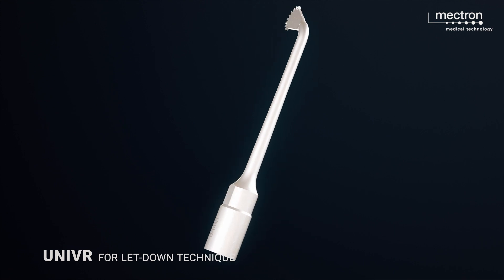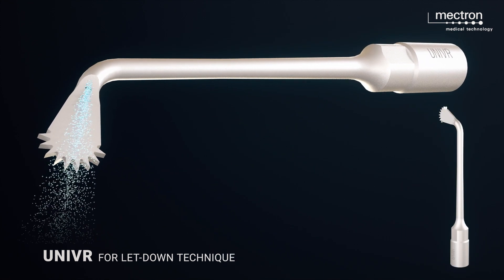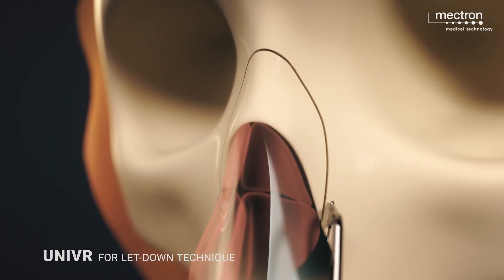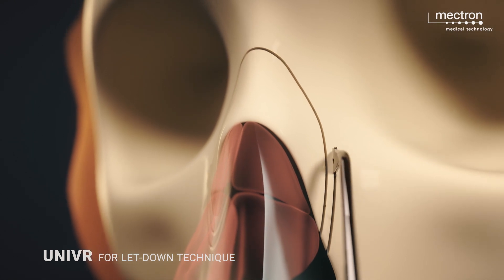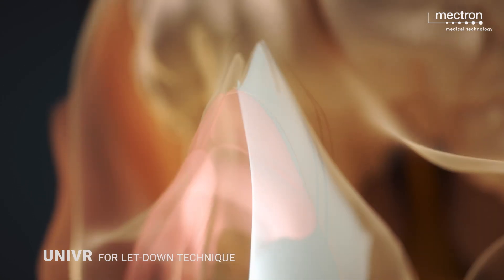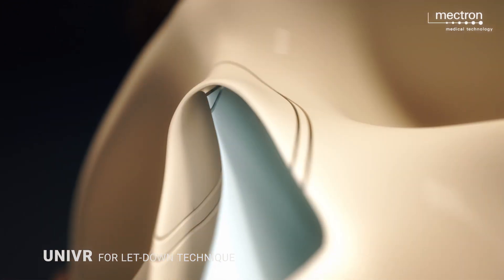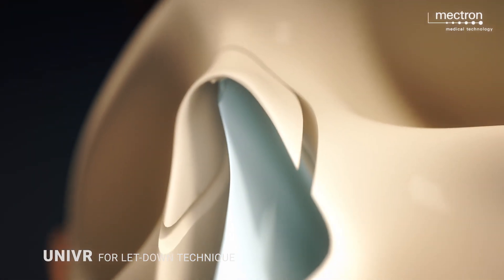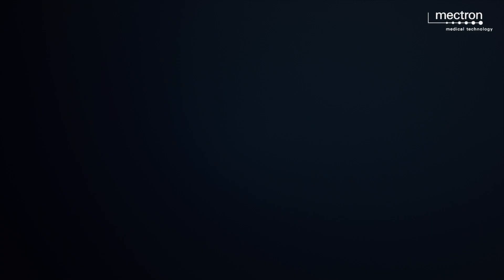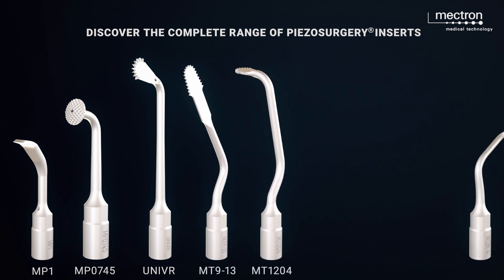With the universal insert, the resection of a bone segment of the side wall can be carried out in a well-controlled manner, as can the resection of a subdorsal strip, which enables an effective push down or let down. A wide range of inserts gives the surgeon the choice of how best to achieve the surgical goal.